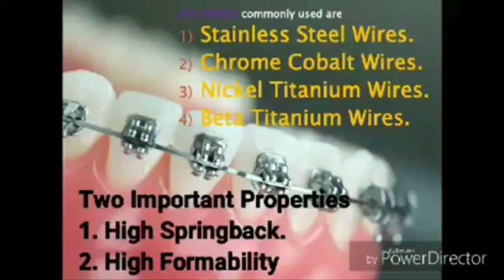Number 1, stainless steel wires. Number 2, chrome cobalt wires. Number 3, nickel titanium wires. And then number 4, beta titanium wires.